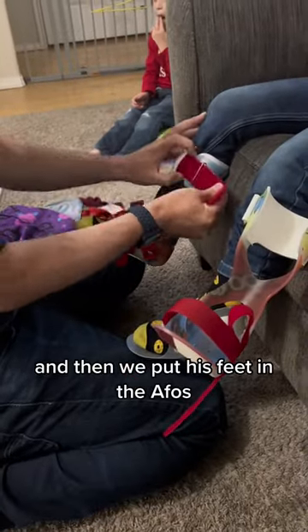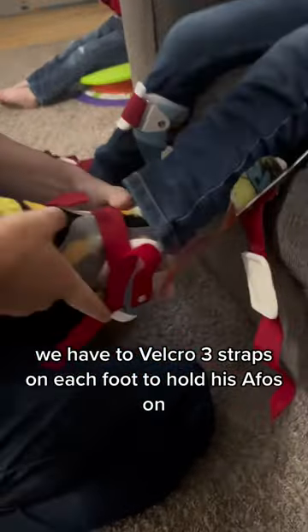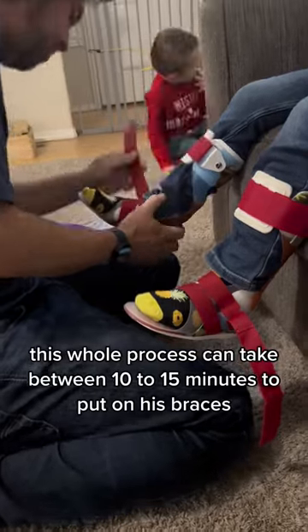And then we put his feet in the AFOs. We have to velcro three straps on each foot to hold his AFOs on. They snap in quite easily to both parts of the brace. This whole process can take between 10 to 15 minutes to put on his braces.